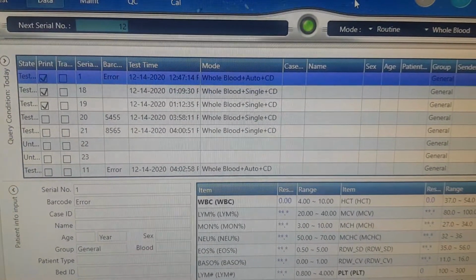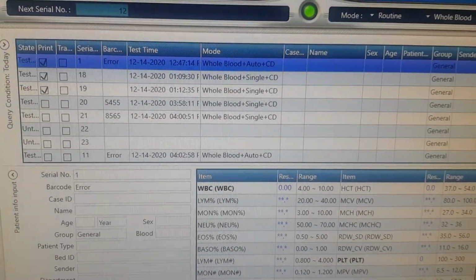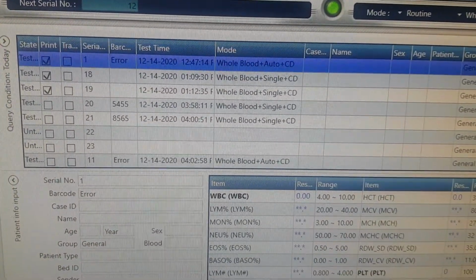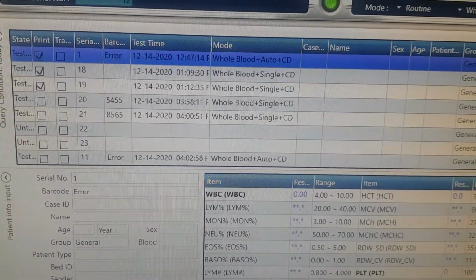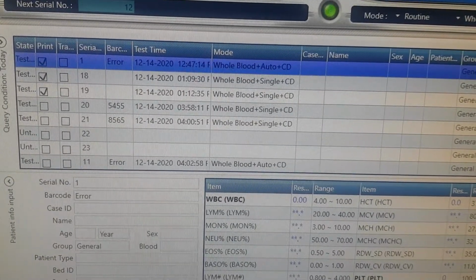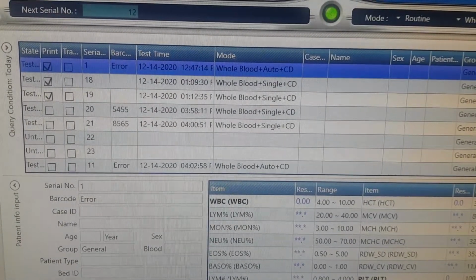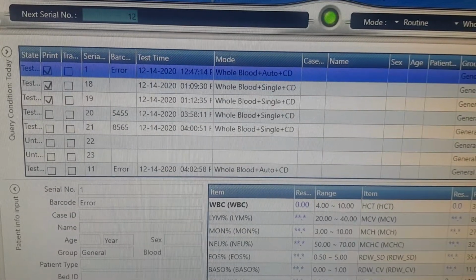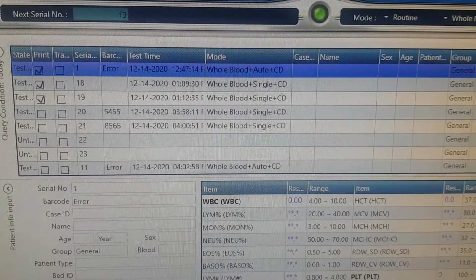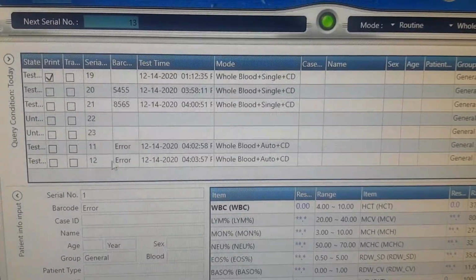So this is how we can distinguish between the racks, in which rack it is running, and also in which position it is running. You will see the next sample, the next result will be serial number 12, and if there is any barcode, it will show the barcode. Okay, it shows 12. Number 12 also there is no barcode.